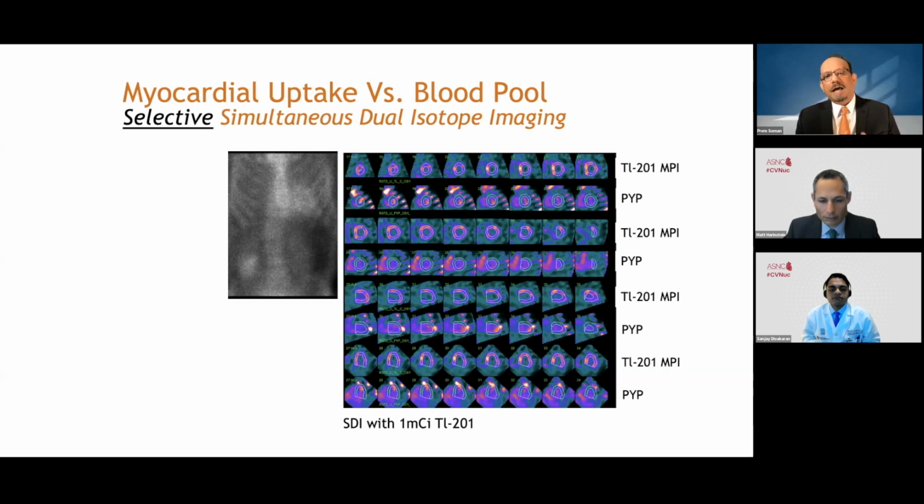And you have to balance that additional radiation dose with the possibility of avoiding a biopsy under fluoroscopy. So there is the radiation associated with fluoroscopy and the small but definite risks associated with a biopsy. And we find this very, very useful.